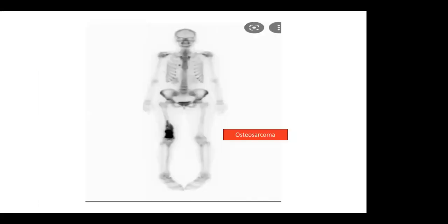Okay. The next indication would be assessing primary bone tumor. For instance, I'm going to give an example of osteosarcoma. It's a primary bone tumor. When the primary bone tumor is proven histopathologically, what we need to do next is to estimate the extent of the tumor involvement, whether it is localized or has a skip lesion. Doing a whole body CT scan or X-ray may not be feasible. Hence, we can use a simple method, a bone scan, where we can pick up whether it is localized or has already gone elsewhere in the bone.